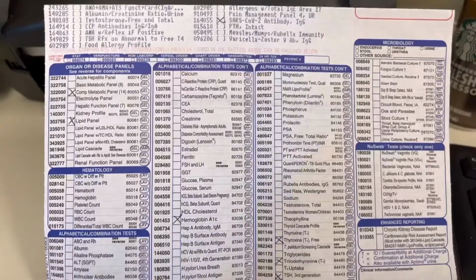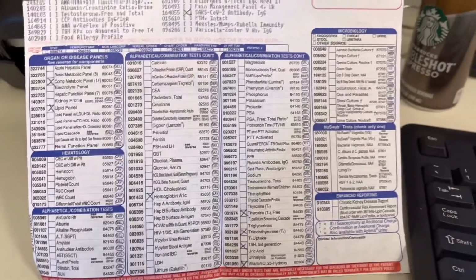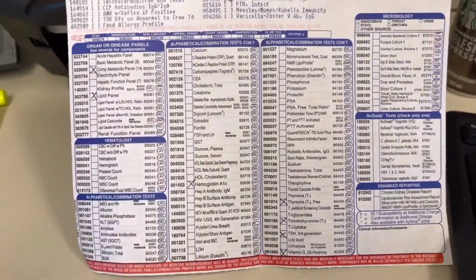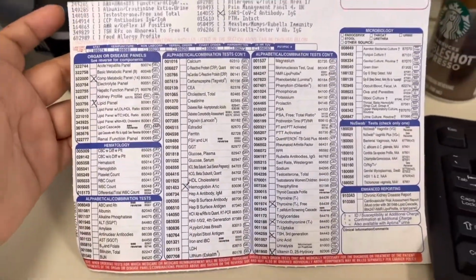Okay, so this is called an order requisition from the doctor. You guys would probably see this. It is a Labcorp requisition. I'm going to show you guys a picture of it around here, but I folded it this way just so you guys don't see the patient's information.